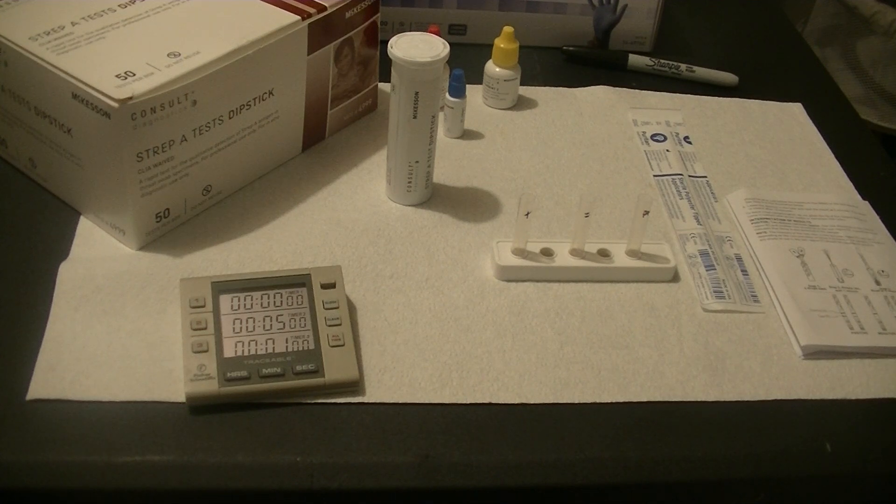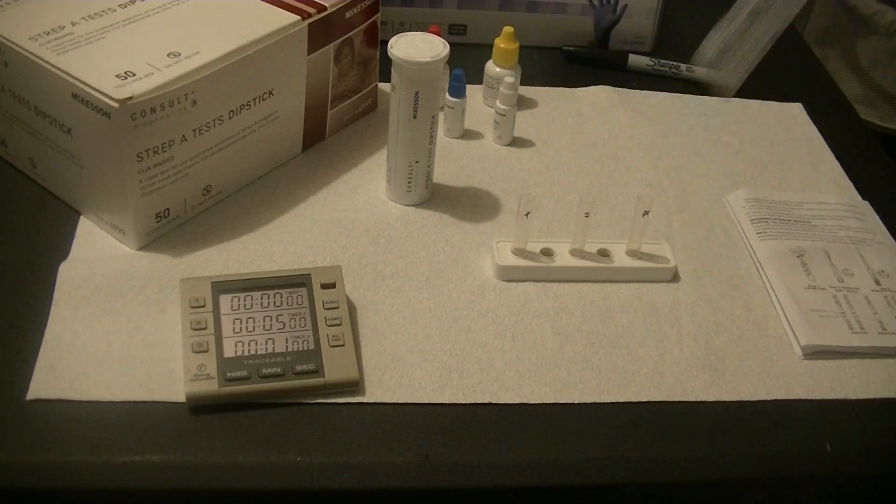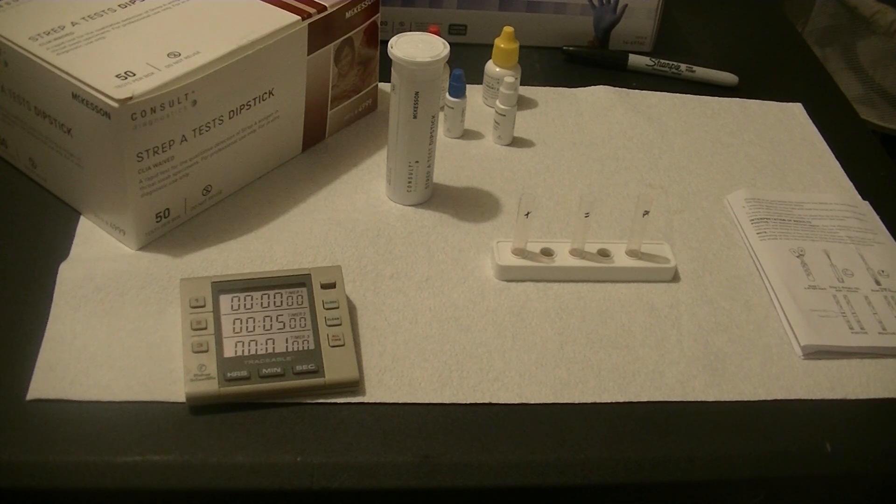Patient sample is going to be a little more complicated because you have to collect the sample. So collect the throat swab.